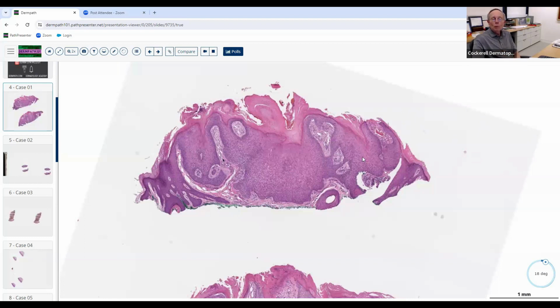But basically, when we say epithelial, we mean any structure that has epithelial differentiation of any kind, like follicular, eccrine, apocrine. Obviously, basal cell, that's an epithelium. So it basically means any kind of structure that's got keratin in it at some level. So it's epithelial in a way. And then you have to say, well, what kind of epithelium is it differentiating toward? Right, it's absolutely benign.